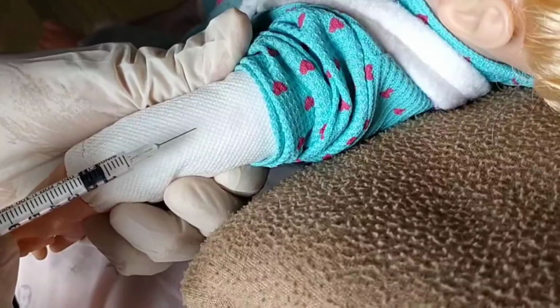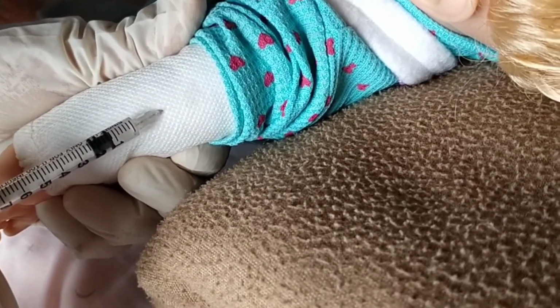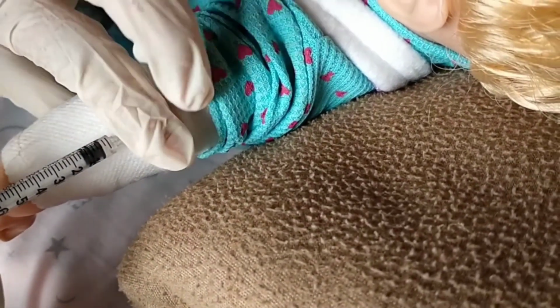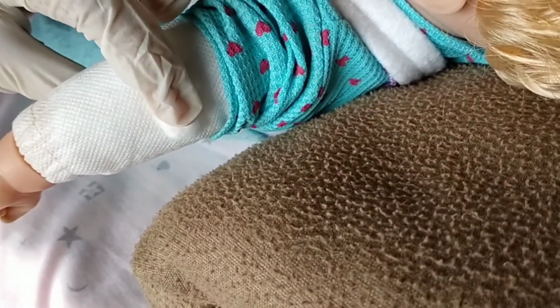After the needle is in place, release the tissue, and if you have a large skin fold pinched up, ensure that the needle stays in place as the skin is released. Immediately move your dominant hand to steady the lower end of the plunger and avoid moving the syringe. Inject the medication slowly, and withdraw the needle quickly, and using a gauze square apply gentle pressure to the site.